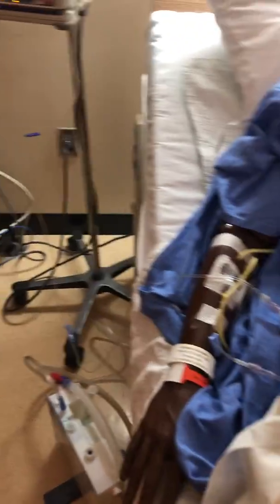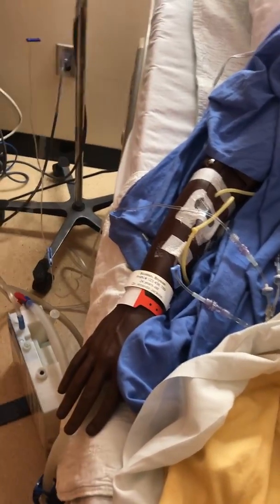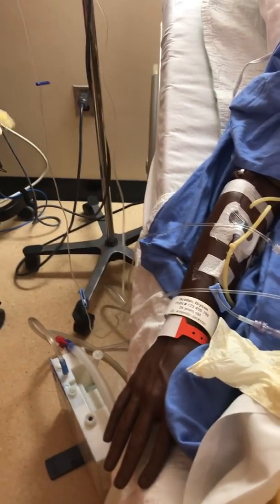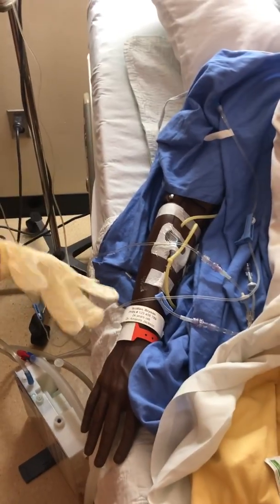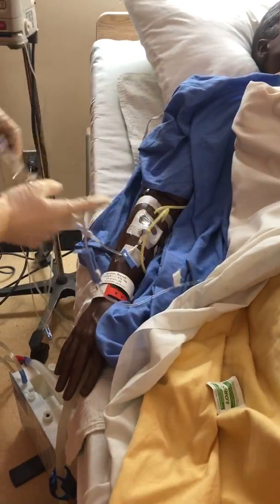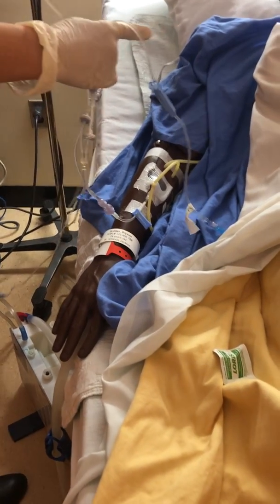So I have here some alcohol swabs. So I've done hand hygiene. I'm going to just put on gloves just in case. And then we are going to get this ready. So I have followed this line and know that it goes to my TKO of normal saline.